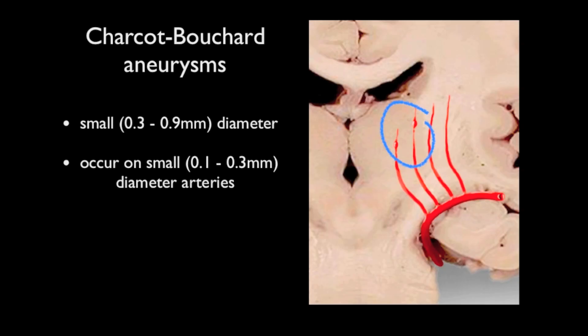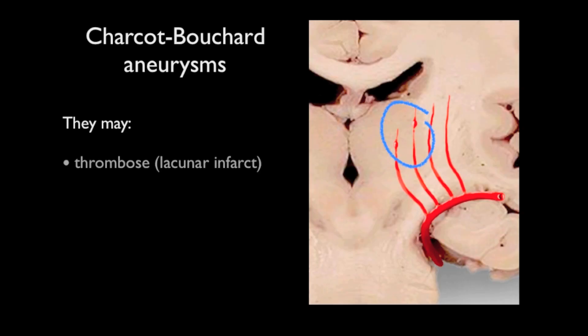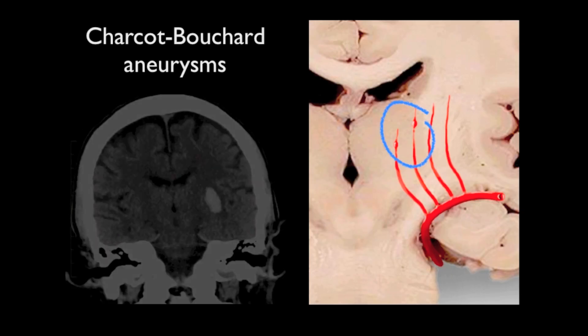Charcot-Bouchard aneurysms are somewhat controversial and are not usually identified on imaging. The distribution of these aneurysms matches those of hypertensive hemorrhages, with most being found in the lenticular striate vessels of the basal ganglia. These aneurysms arise as a result of chronic changes within the walls of these perforating vessels, which can go on to either thrombose — causing a lacunar infarct — leak resulting in micro hemorrhages, or rupture resulting in a true hemorrhage.